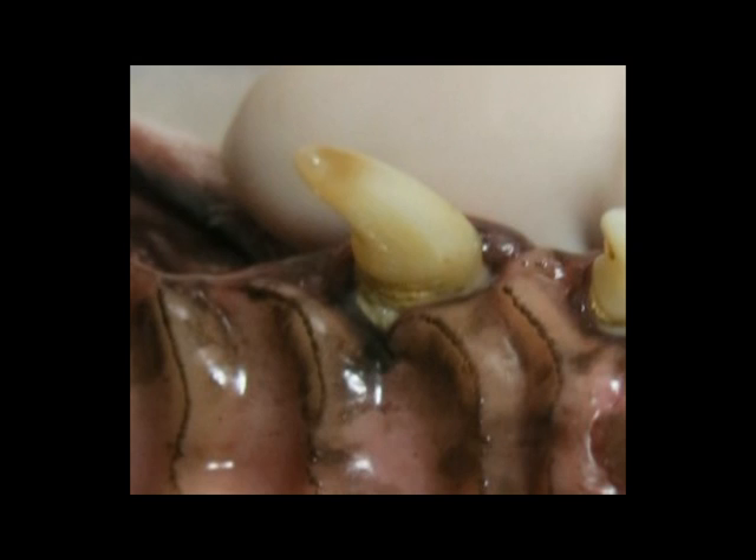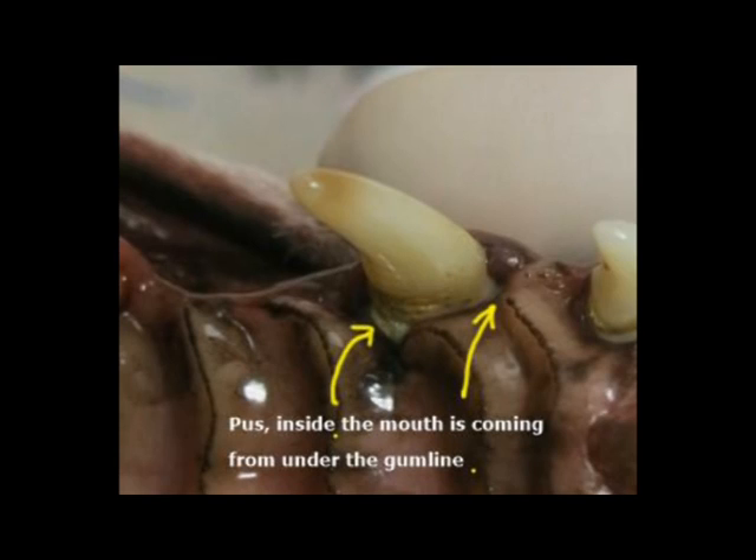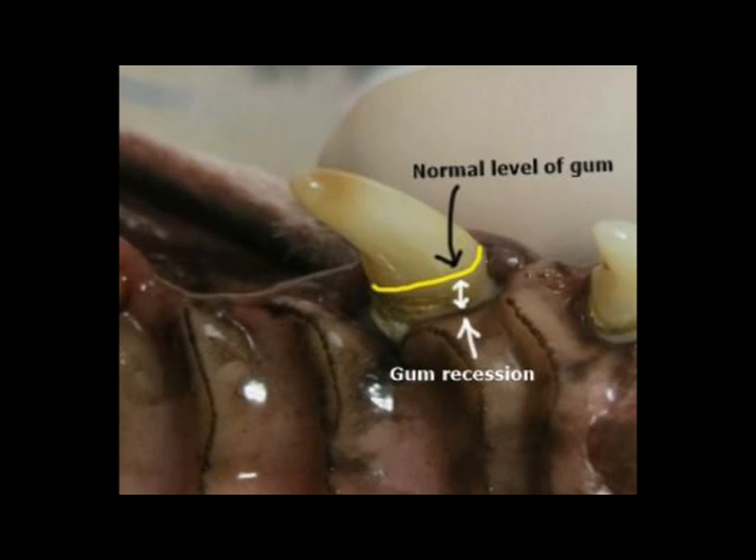This is what is found inside the mouth on the palatal side of the tooth. At the front of the tooth the pocket was eight millimeters deep and at the back of the tooth the probing depth was five millimeters — that's how much bone was missing. See the pus coming out from underneath the gum line? Look at where the normal gum line should be. This shows that there is a lot of gum recession, so there is a lot of bone loss underneath the gum.